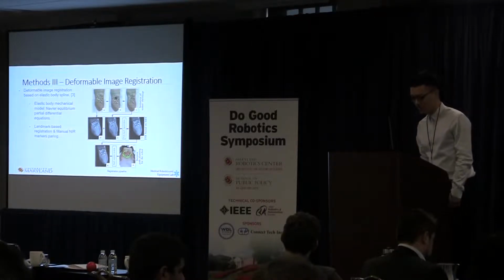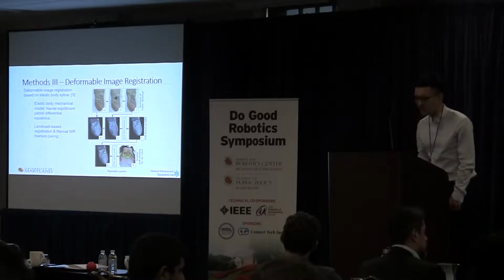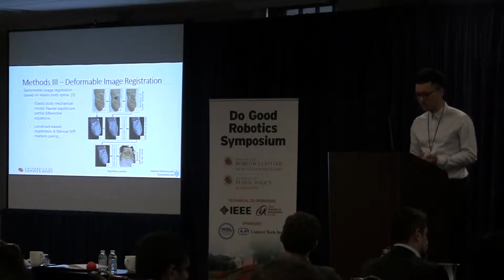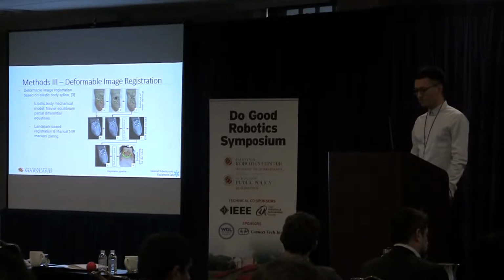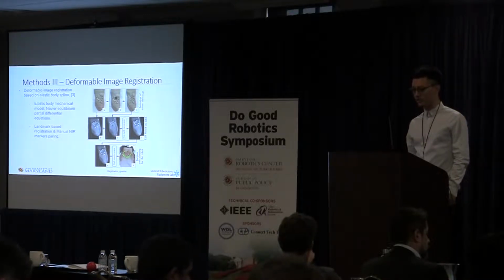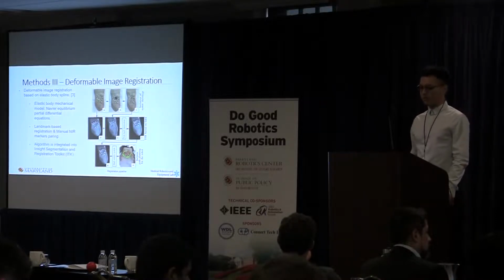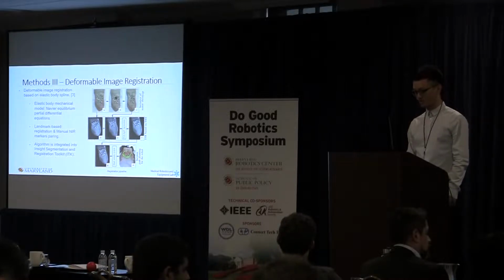Image D shows how image A looks in the near-infrared images, and image E shows how C looks. So this method will warp image D to match the coordinate system in image E. Image F is the registered image and also the registered tumor bed. We didn't implement this algorithm ourselves. This algorithm is already integrated into the Insight Segmentation and Registration Toolkit. It's a very famous toolkit in the medical image processing area.